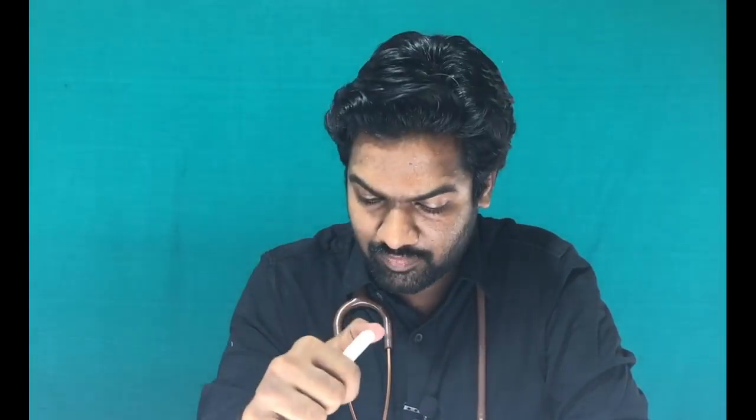Now, there is this question that they have mentioned: in kyphosis and scoliosis, what kind of spinal needle would you use? Wherever you want to put this needle, you have to know the basic fact of anatomy that the spinal cord ends at L2 and L3, and L4 is one of the safest places to do this LP, so that the nerves will not get damaged. In kyphosis and scoliosis, rather than the needle, we have to concentrate more on where the spinal cord ends, I feel. The precaution is to go much lower, based on how much degree of kyphosis or scoliosis there is. Based on that, the needle must be pricked at the site. Here we have to concentrate on the site rather than the needle, I feel. Any other questions?